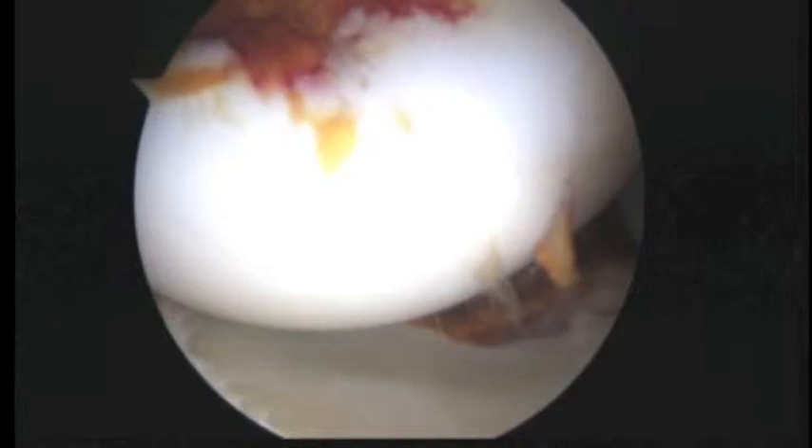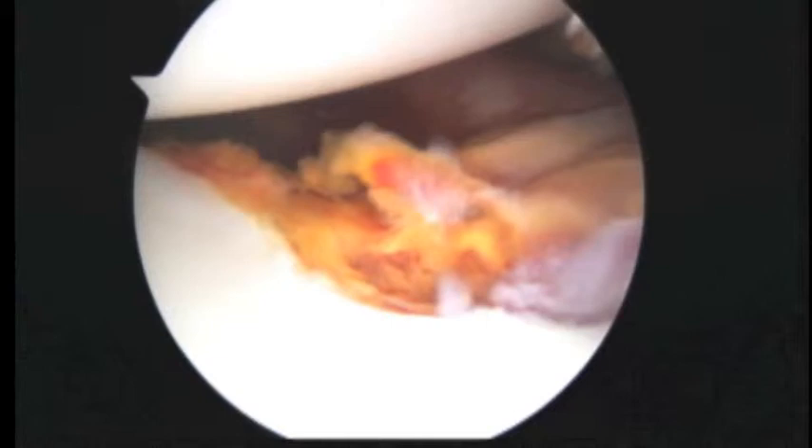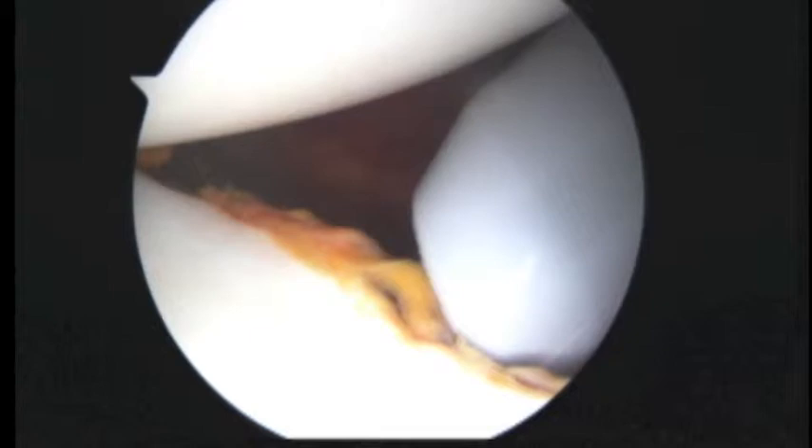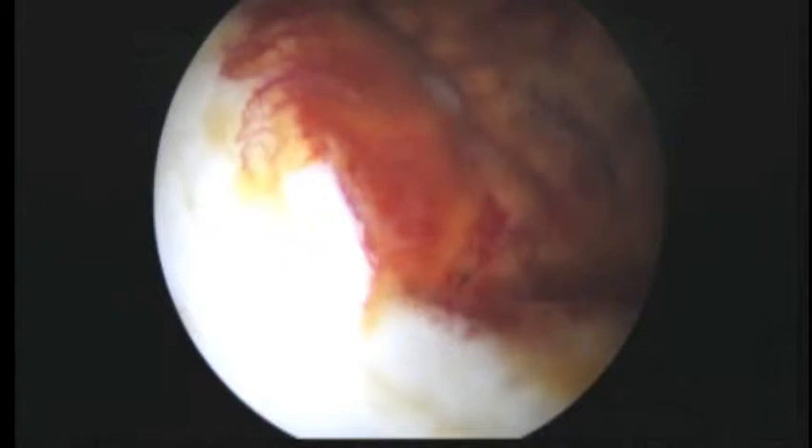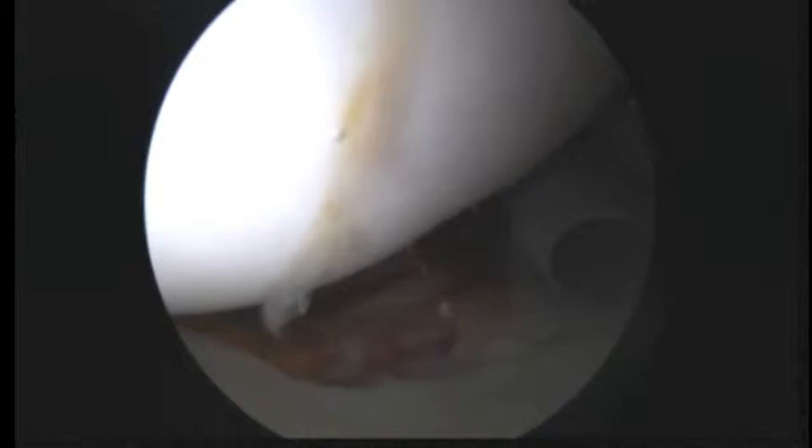The rest of the articular surfaces actually look pretty good. We're going to look down the front of the shoulder now and have a look at this area, which is where there's been some damage. That'll be easier to see once we put the camera in the front. The main decision we have to make now is what we're going to do in the back of the shoulder. From what I'm seeing, I do not think we're going to have to do what we call a remplissage.